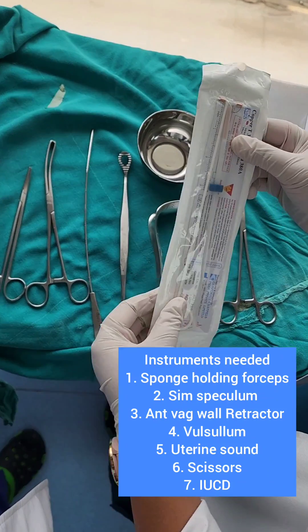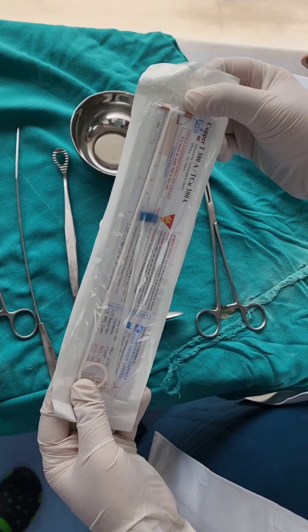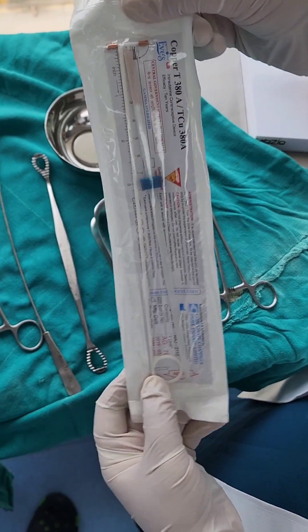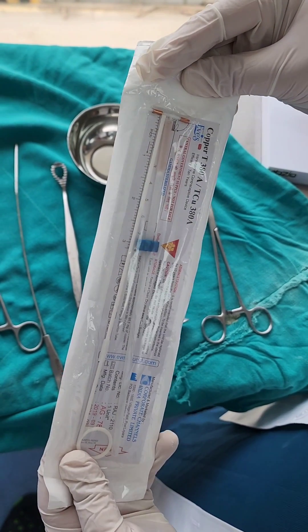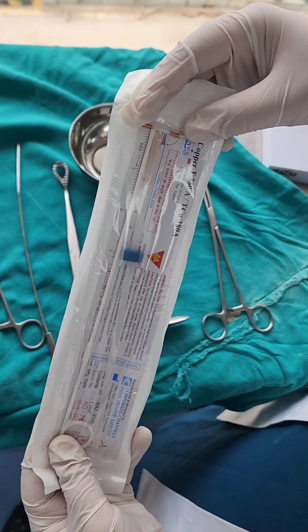And of course we also need a copper T. Very important when we insert — this is a copper T 380A. Very important to understand is that we use a no-touch technique to maintain sterility.